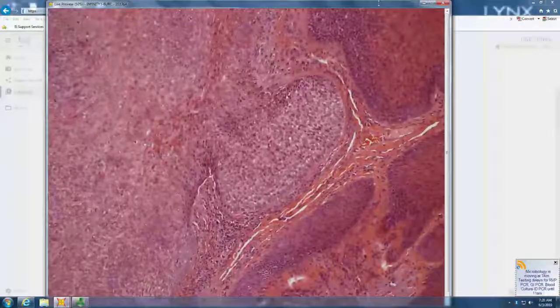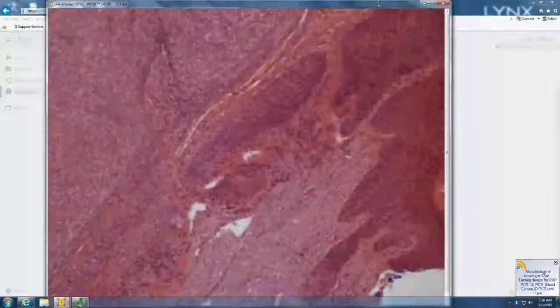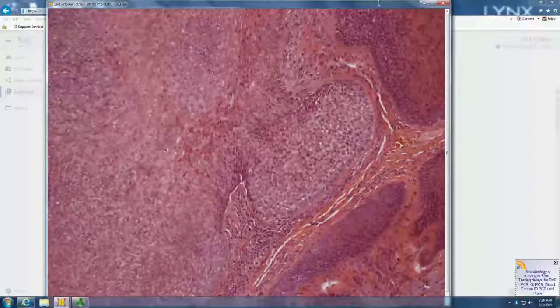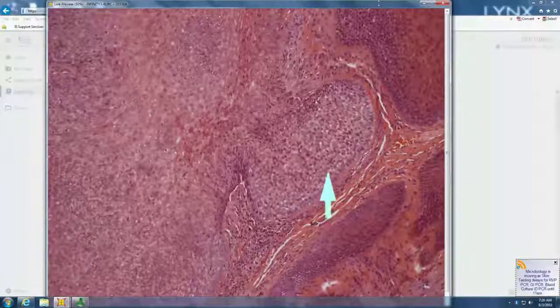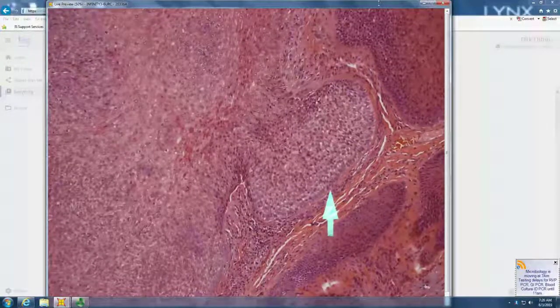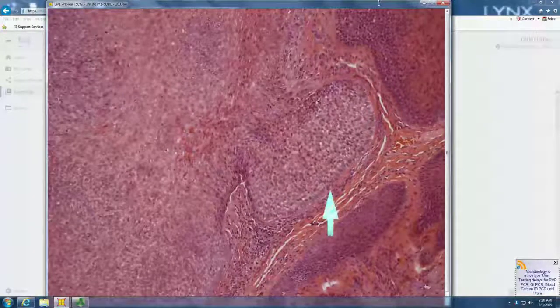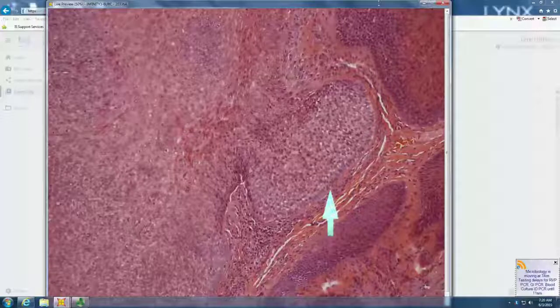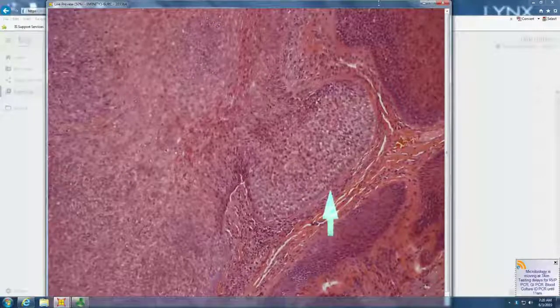Inflammatory or tumor? Well, leaning toward inflammatory. Do you see inflammatory cells, or do you see an epithelial mass? Epithelial mass. Epithelial mass composed of pale cells hanging off the epidermis, peripheral palisade, thick basement membrane zone. Cylindromal. So thick basement membrane zone, similar to what you'd see in a cylindroma, that fits together like a jigsaw puzzle and has no cytoplasm to the cells. Hangs off the epidermis, looks like the outer root sheath of the follicle.